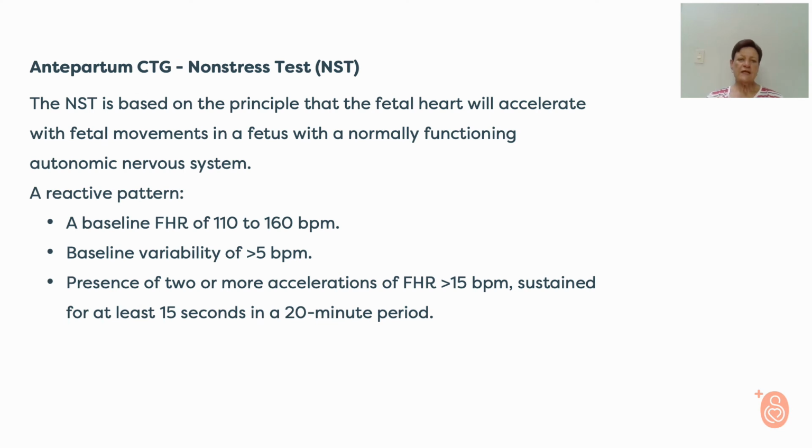Then if we just quickly look at the antepartum CTG, or what we also call the non-stress test, it's based on the principle that the fetal heart rate will accelerate with fetal movements. And those are usually the things that we are looking for. You will see here we talk about a reactive pattern. Reactive means, the name exactly says what it means. The fetus is reactive. We get a baseline of 110 to 160 beats per minute, which is a normal baseline.